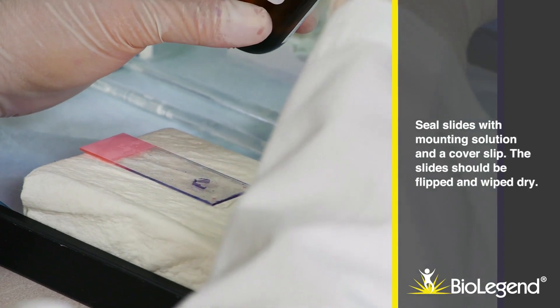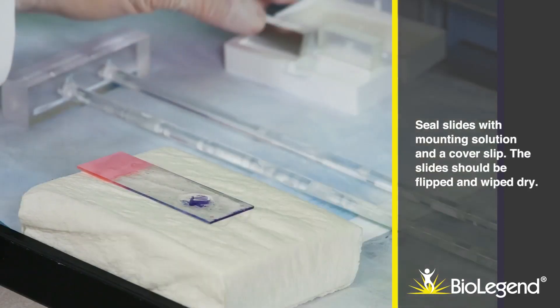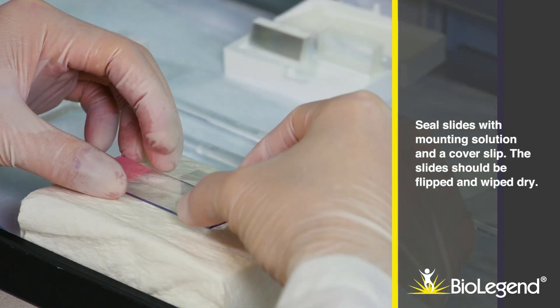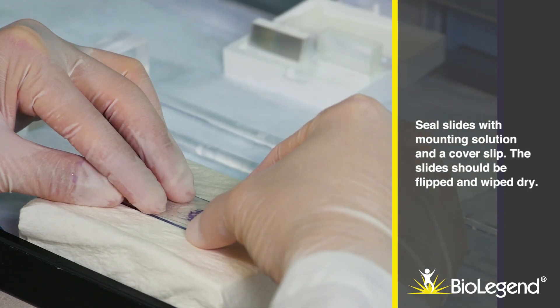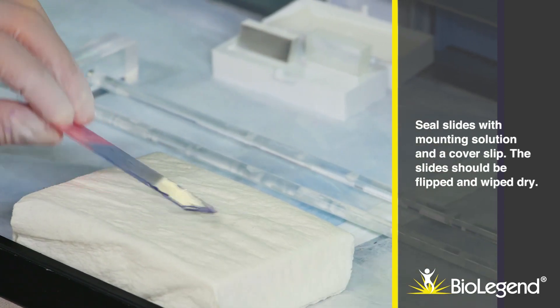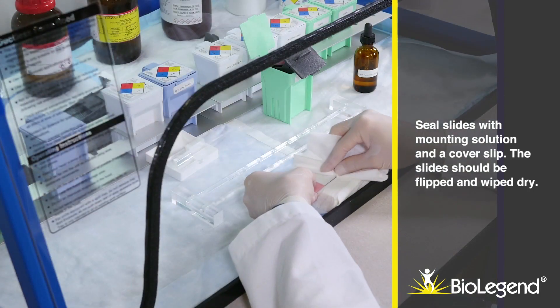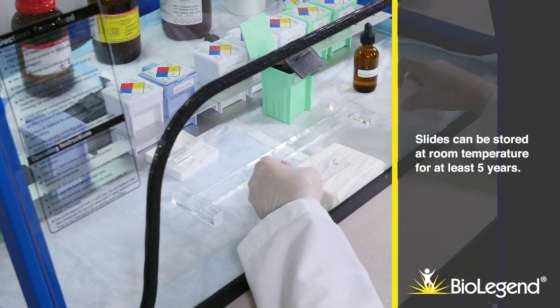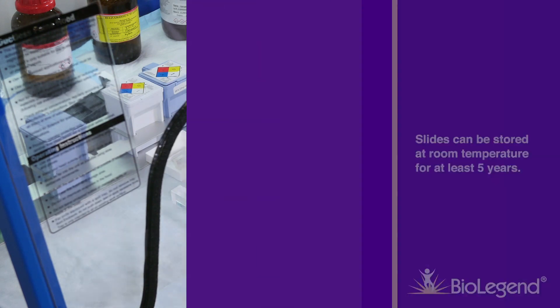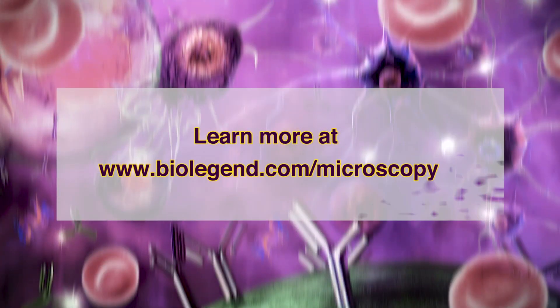Apply mounting solution and a cover slip to the slides; the slides should be flipped and wiped dry. Slides can be stored at room temperature for at least five years. Learn more at www.BioLegend.com.